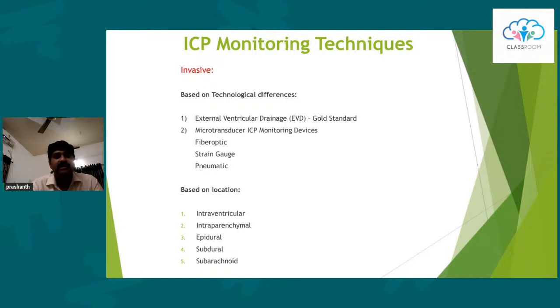The other way of classifying the ICP monitor is based on the location. This is primarily of historical interest only. Anyway, I just mention it for the sake of completion: intraventricular, intraparenchymal, epidural, subdural, subarachnoid.